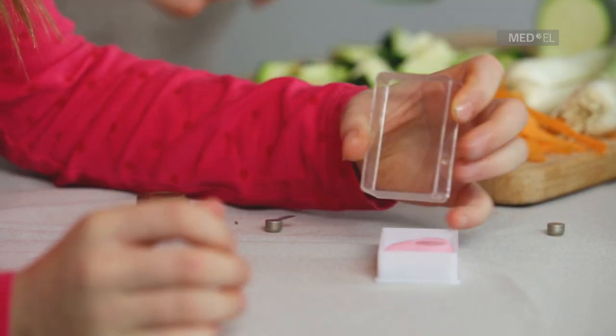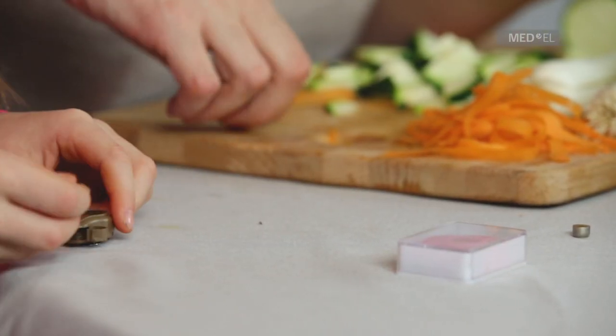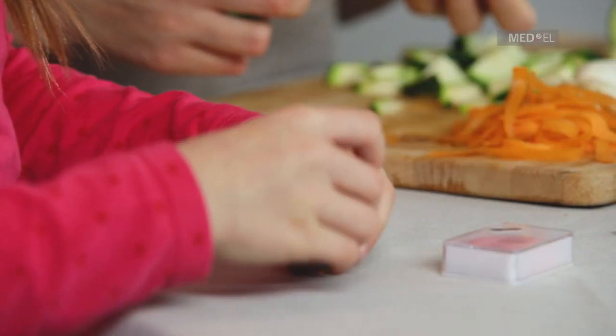Place the new battery in the compartment with the plus sign facing upwards and remove the tab covering the battery. Close the compartment and click the audio processor back in place.